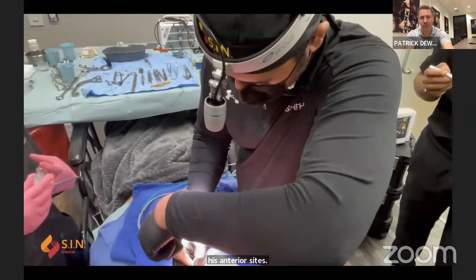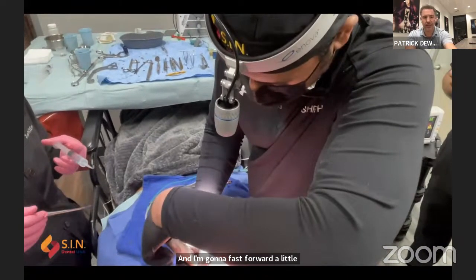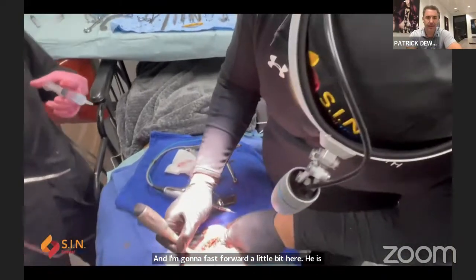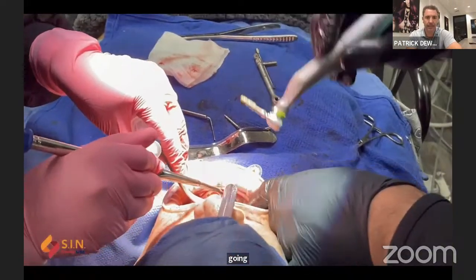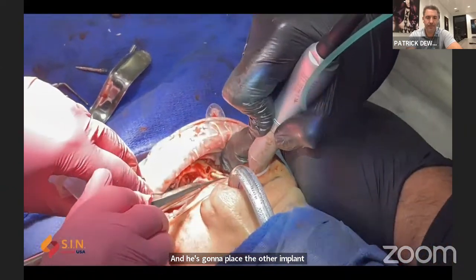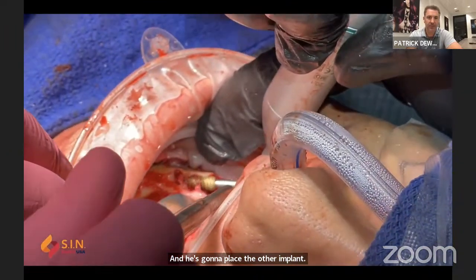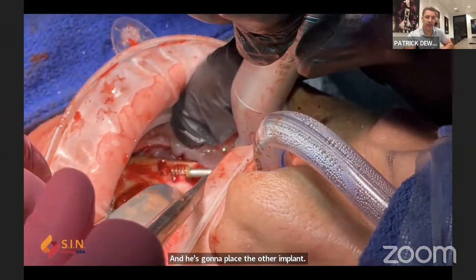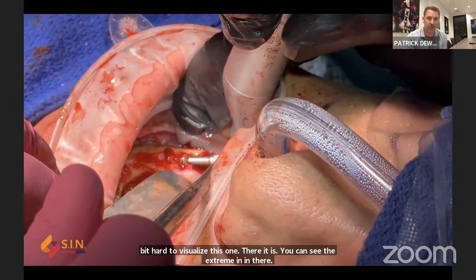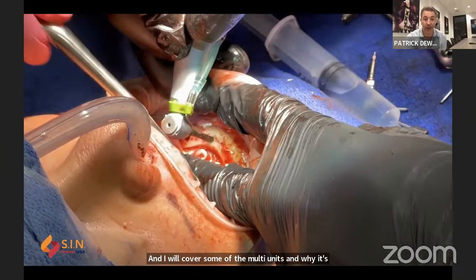And I'm going to fast forward a little bit here. He is going through, placing on his multi-units, and then he's going to place the other implant. A little bit hard to visualize this one. There it is. You can see the extreme angulation there. And I will cover some of the multi-units and why it's important to have the proper multi-units to execute these cases with angulation.